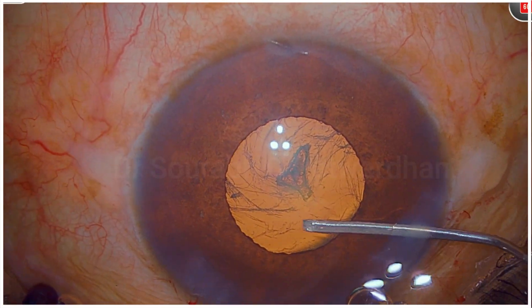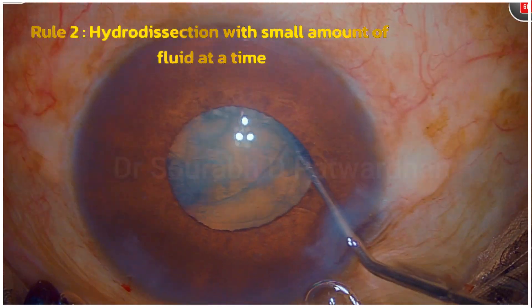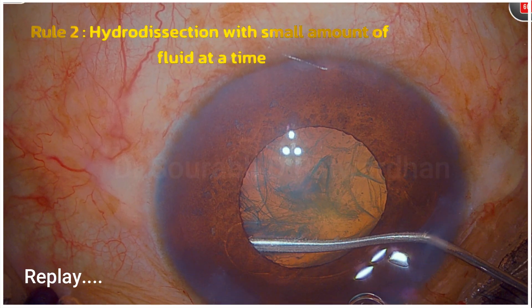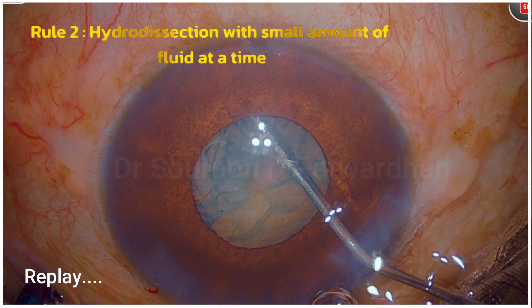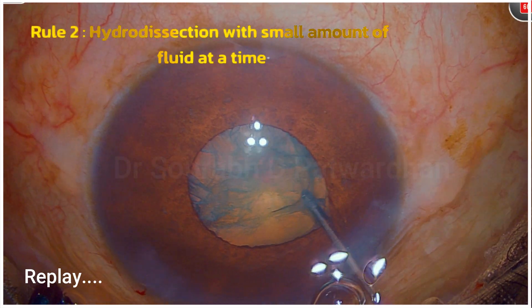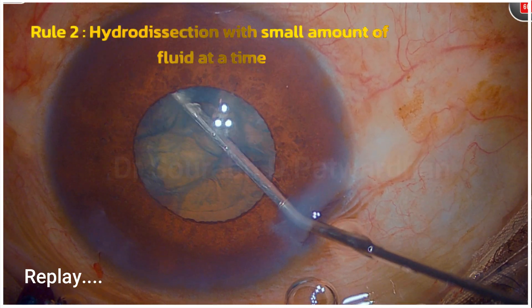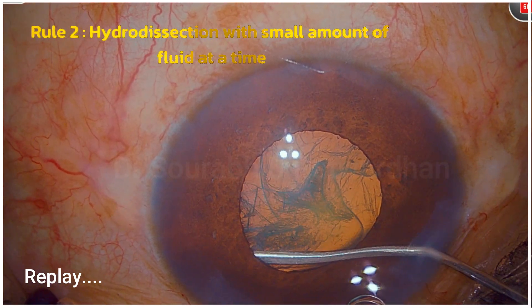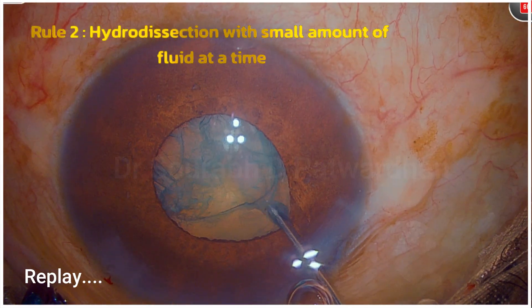This part requires quite some experience — I am doing hydrodissection with very small amounts of fluid at a time, because if I inject too much the iris is going to prolapse. With a single fluid wave I could achieve complete hydrodissection and even rotate the nucleus immediately after. For beginners this might be difficult, as you need to know exactly how much and where to inject. Watch this part again and again; as you gain experience you become more confident.